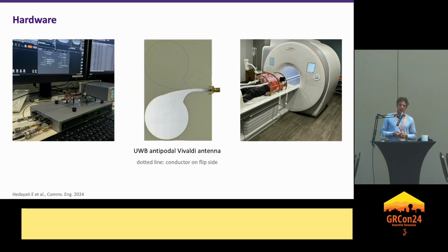The antennas had been designed in-house for a different project. They have ultra-wideband characteristics. They are efficient, approximately from 0.5 to 10 gigahertz. So we thought, this is an interesting antenna, let's reuse them for our radar system.